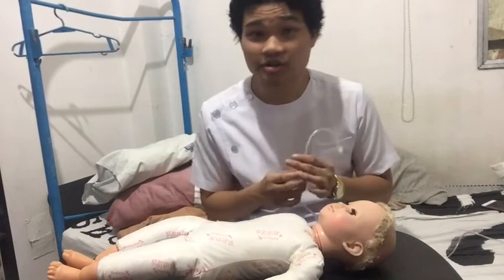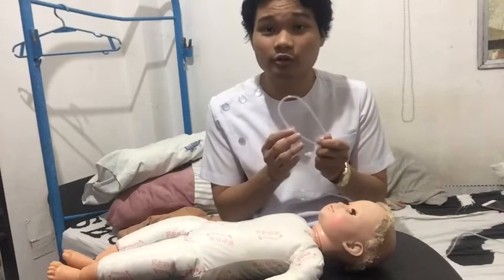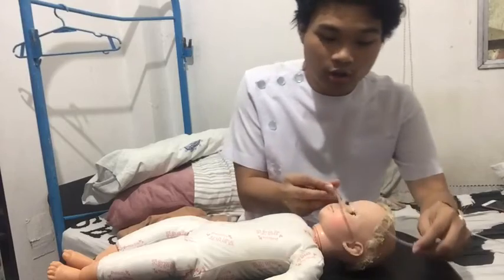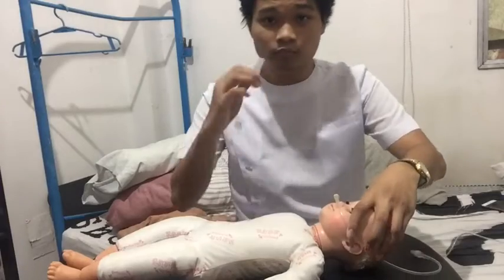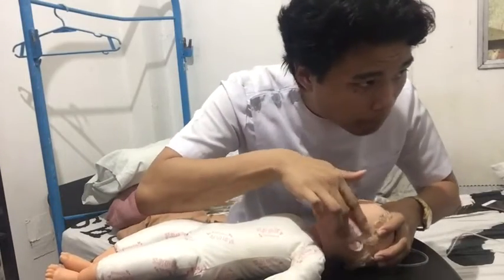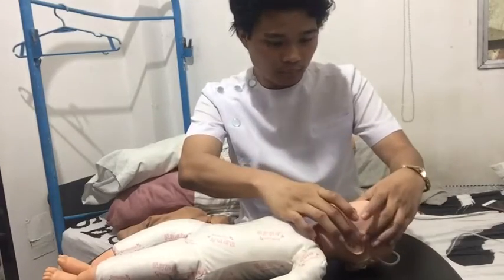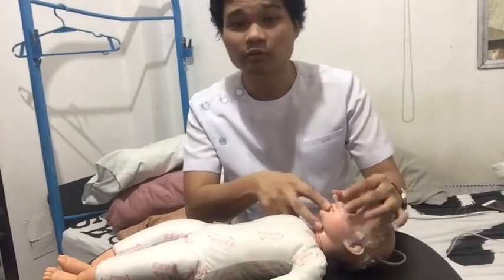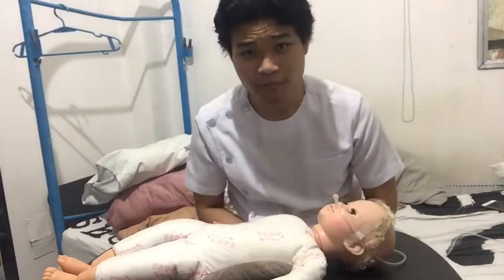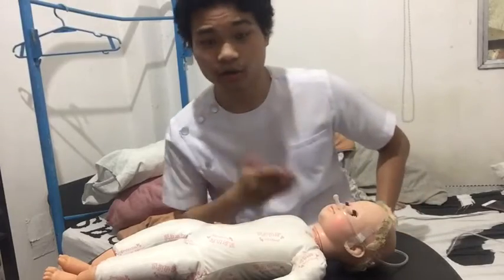After attaching it to the oxygen tank and adjusting it to the desired flow rate, we're going to be following the proper instructions of the cannula on how to place the oxygen. So we're going to have to put the cannula on the baby. So after putting on the cannula properly, wherein the baby is breathing properly, we're going to be assessing the client's breathing, and if there's any problems or further adjustments that need to be done, we're going to have to adjust.